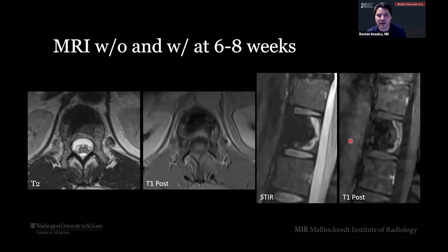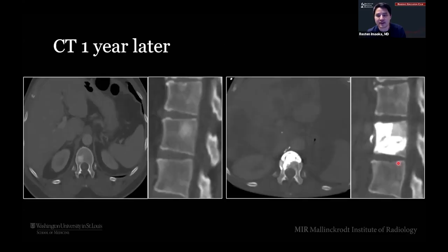And then this is what it looks like about 2 months out. All right, so here we've got our T2s or T1 posts. You can see the post-ablative changes here at all this cement and dead stuff here. And then it is normal to see this rind of granulation tissue at the periphery of the ablation zone, right? So this is not any residual disease or anything. This is just viable granulation tissue at the edge of your ablation zone. And if we look at a CT 1 year later, these left images are the initial, these right images are obviously the post with the cement in place.